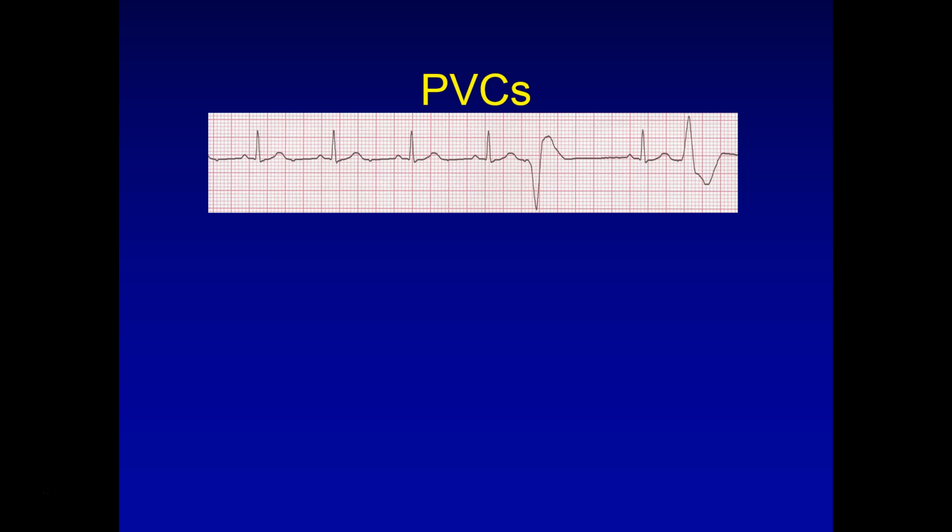So, a good way to remember that is, since lead 2 is the reference lead, we're looking at lead 2 when you look at your patient. Normal impulse should move from, I like to think of it as northwest to southeast, so I like to think of states, and the impulse should be going from Oregon to Florida. Okay, so I know the electrical impulse is moving from Oregon and heading toward Florida.